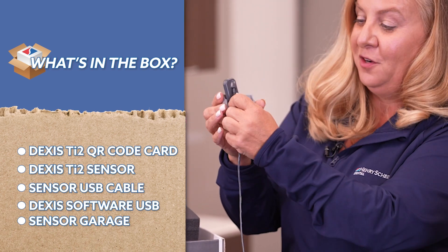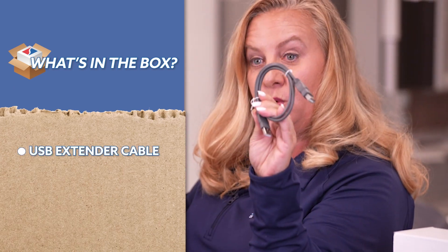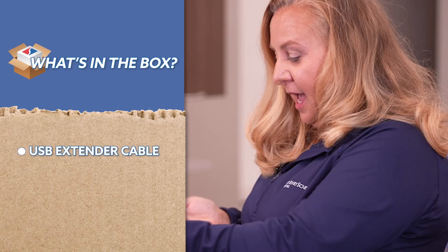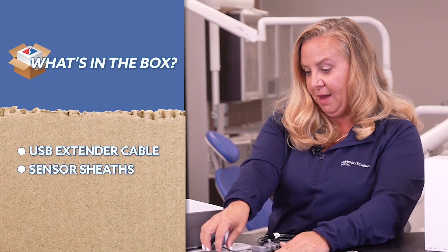For those of you in the dental field, the sensor garage is just where we mount it and stick it to the wall so our sensors don't fall and end up on the floor. The next item is the extension cord, which gives you another foot or so of cable. And then we have our protective barriers — these go over the sensor when you put it in the patient's mouth.